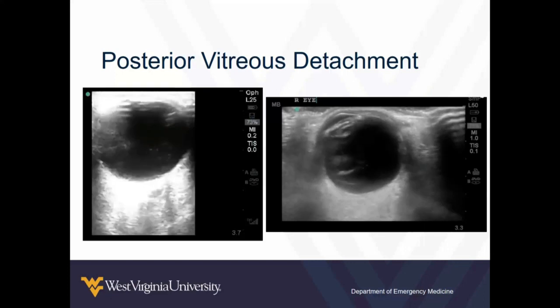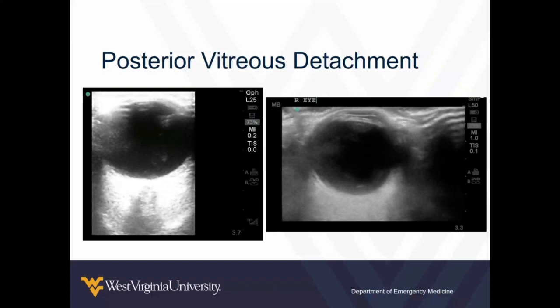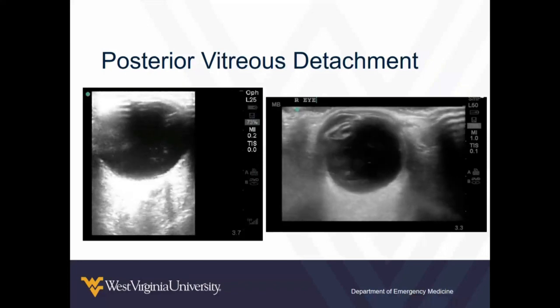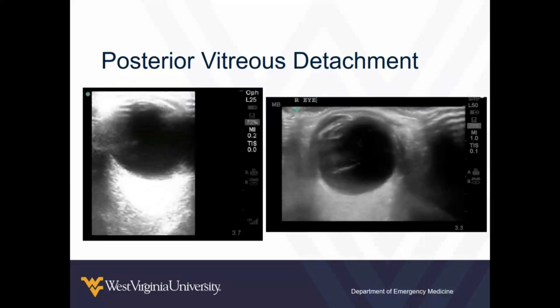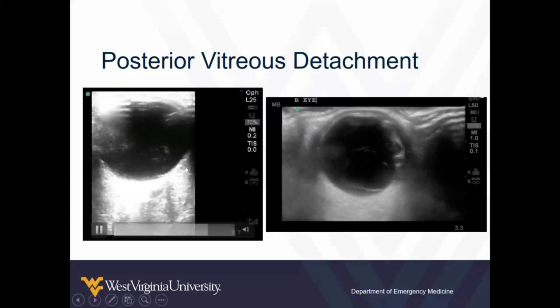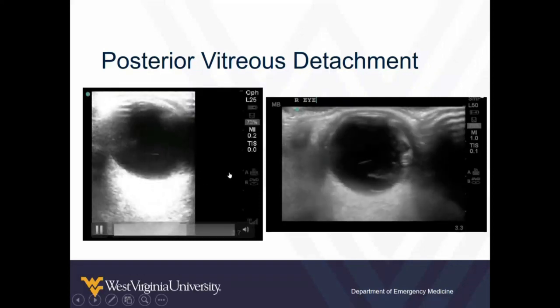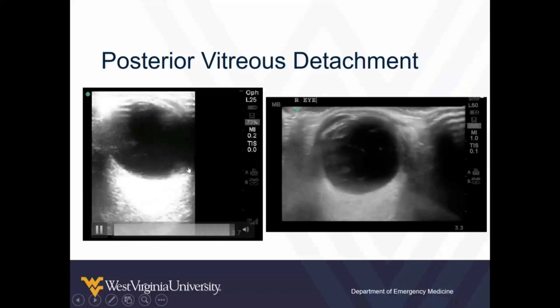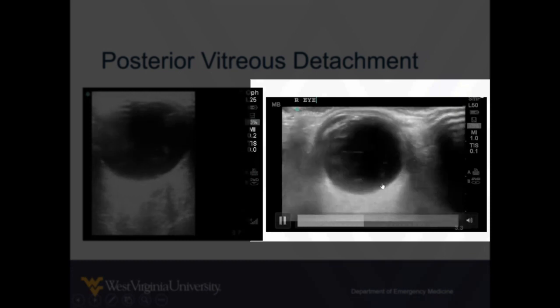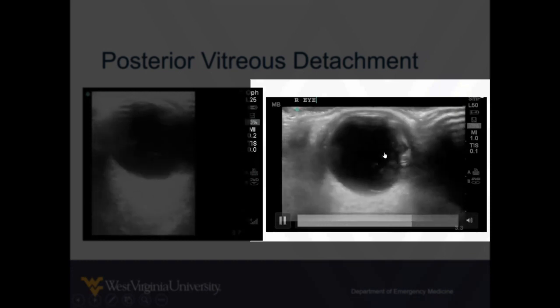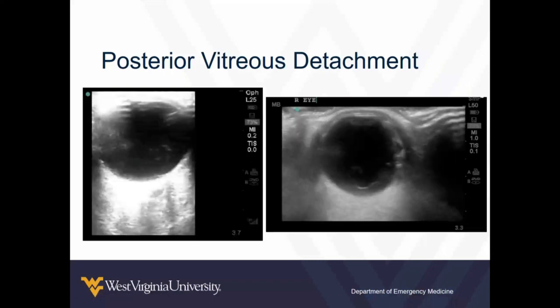The other super common thing that causes painless vision loss — as opposed to the foreign body, which is probably painful — is posterior vitreous detachment. This is probably the most common cause of floaters and painless vision changes that we see. You can see what this looks like — it's not as obvious as retinal detachment. But to the untrained eye, this could look very similar. You see this white stuff floating around as they move, floating around in the back of their eyeball. It looks kind of like sheets. But there are some significant differences between this and retinal detachment.